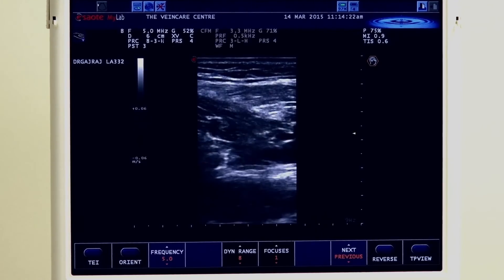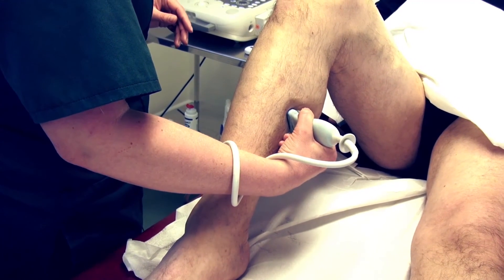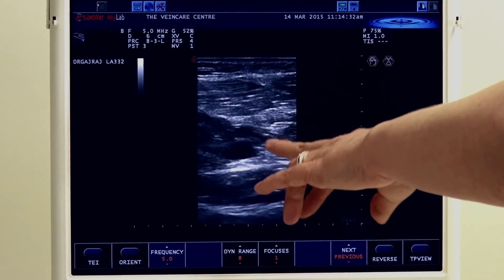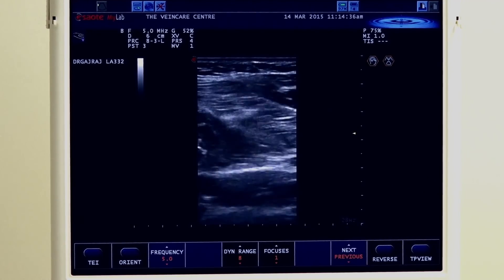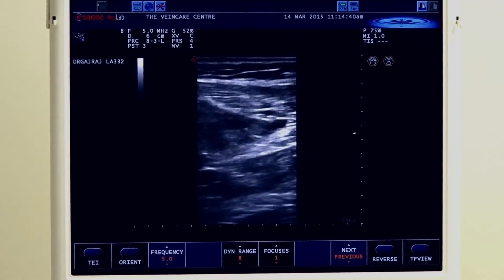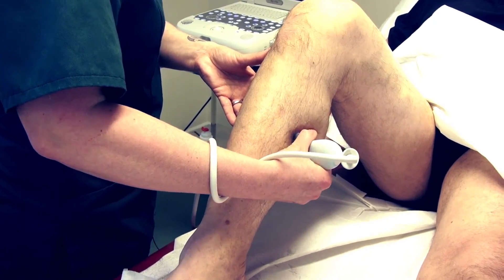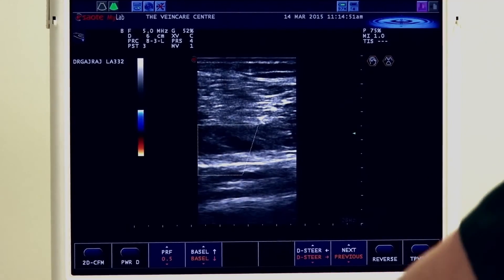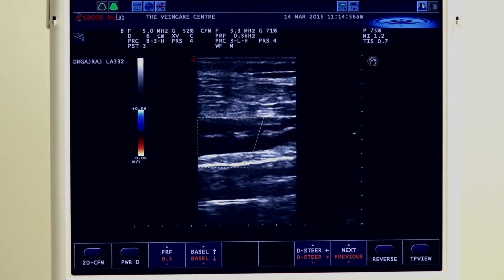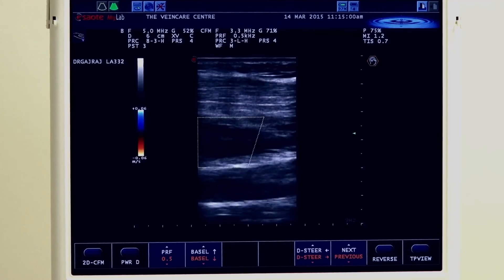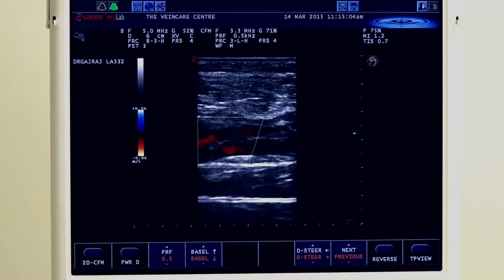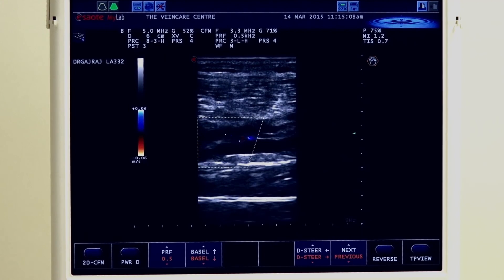The posterior tibial vein is a little bit more superficial, while the peroneal veins are nice and deep. The posterior tibial vein can be seen just underneath the fascial plane. We can compress while holding onto the lateral edge of the calf for stability, then turn 90 degrees into the longitudinal section. We can see paired calf veins — a nice squeeze shows both of those posterior tibial veins fill in beautifully. The posterior tibial artery is also pulsating away in the middle there.